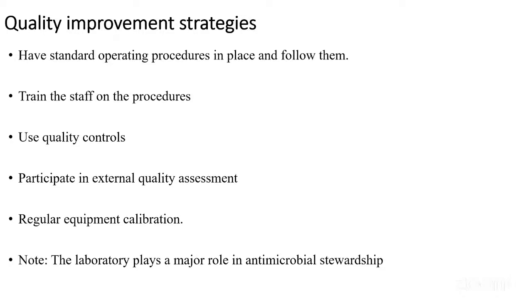So then we have to have regular equipment calibrations. Ensure if it is a microscope, it is functional, so you can observe the microorganisms or the urine without straining. Your microscope should be fit for use. Then your incubator, make sure it is calibrated and within the required temperatures. Your pipettes should be calibrated so that you can be picking the correct amount of solutions when you need to.